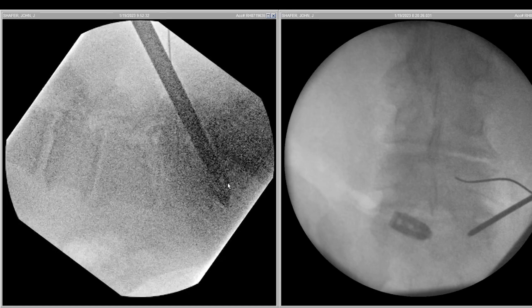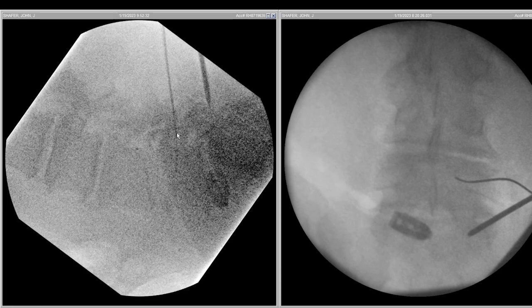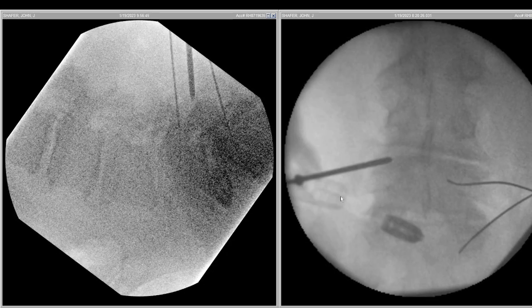After the first cage is inserted, we look at the pictures and modify positioning so we can see the pedicles of L4, L5, and S1 better. Then in this view, we place the K-wires in L4 and S1.